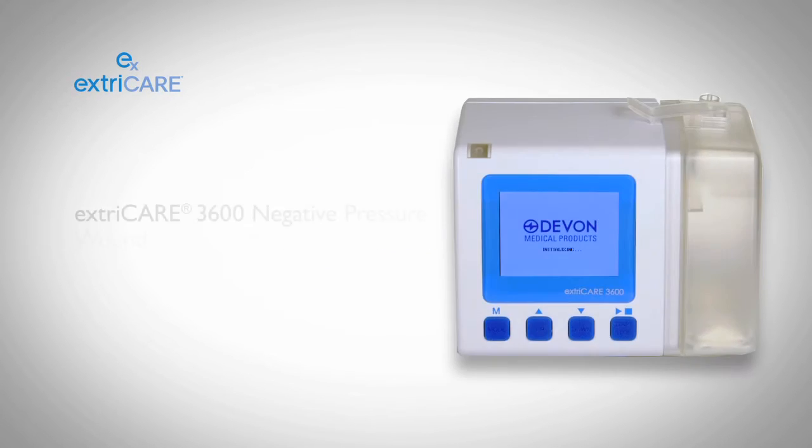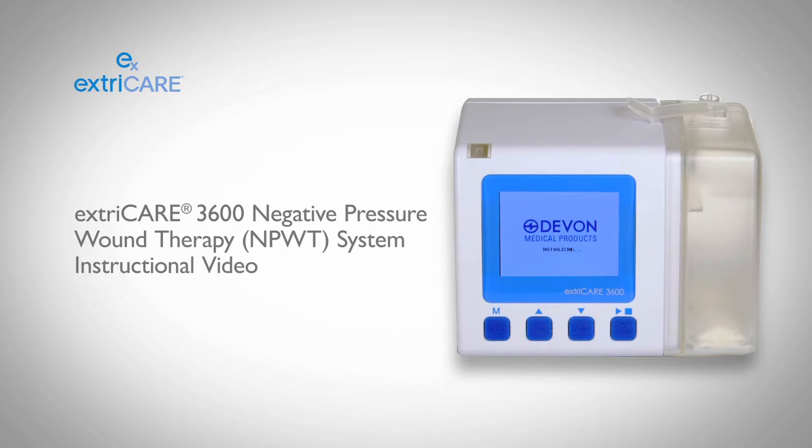Devon Medical Products extriCARE 3600 Negative Pressure Wound Therapy Pump is a clinical grade, portable, battery powered device which may promote wound healing through the removal of wound exudates, infectious material, and tissue debris from the wound bed, using continuous and/or intermittent negative pressure. This pump works with all Devon Medical Products extriCARE all-in-one bandage dressings and foam kits.